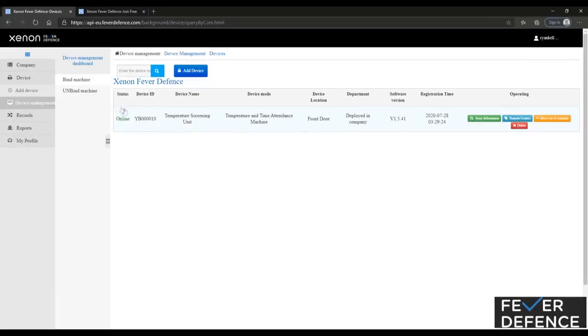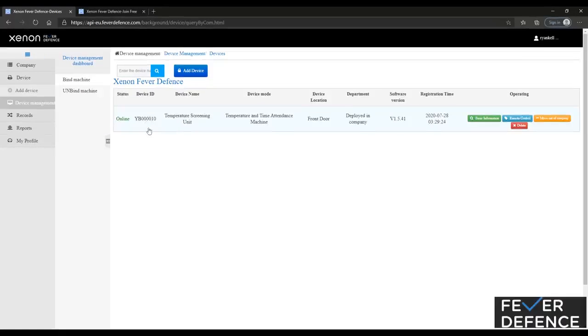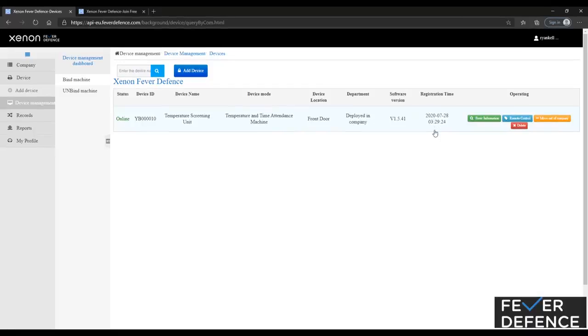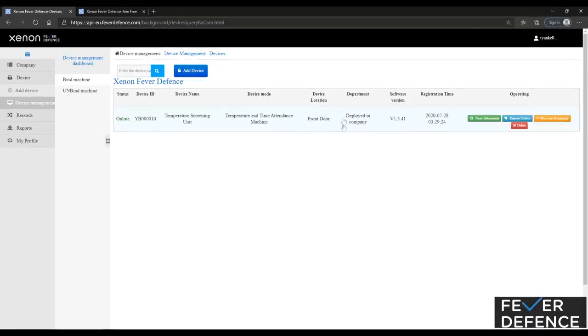Online to your left hand side in green, and you'll have your device ID as so. You'll be able to see other things here, software version, when it's been registered, and the location of the device.